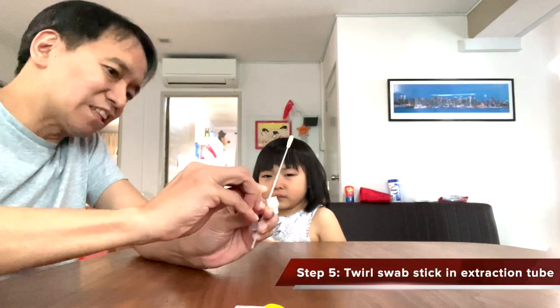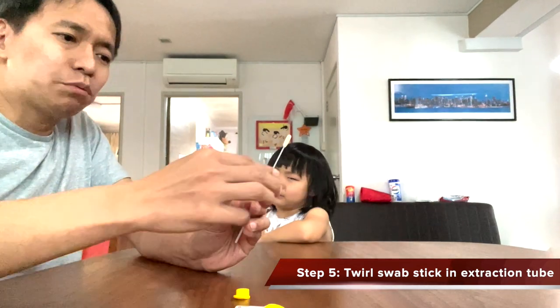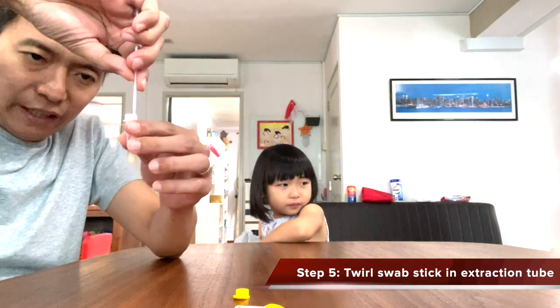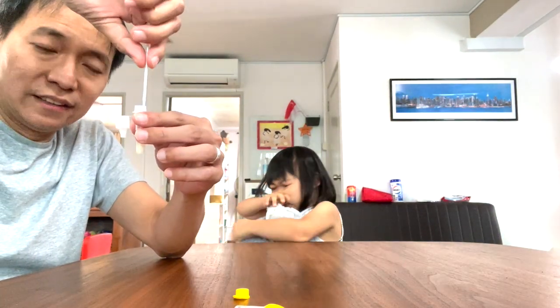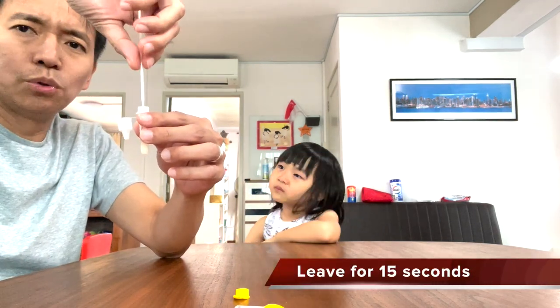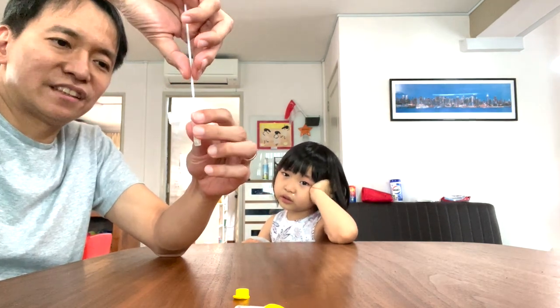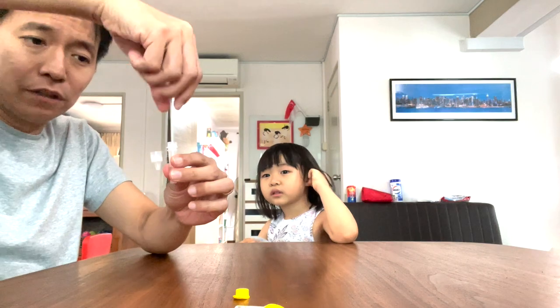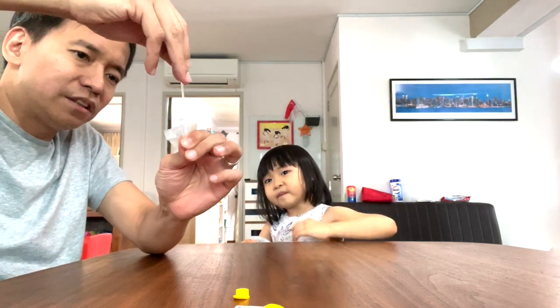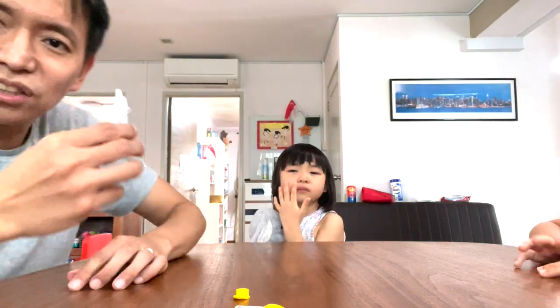Now we have to open the extraction tube. Loosen it and open it. Now what we do is we put the swab in — see this? — put it in, and pull it. Leave it inside for 15 seconds. Then when you are about to pull it out, you squeeze the tube so that whatever fluid is in the swab will stay inside.